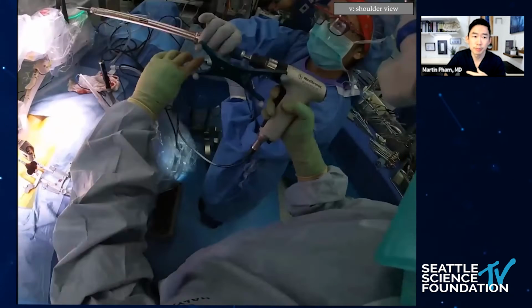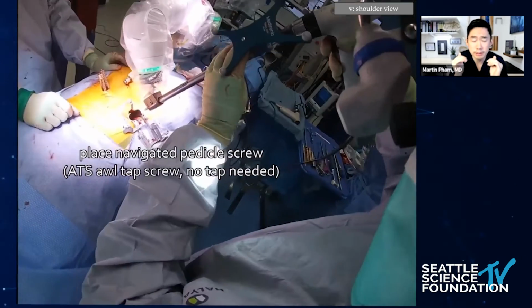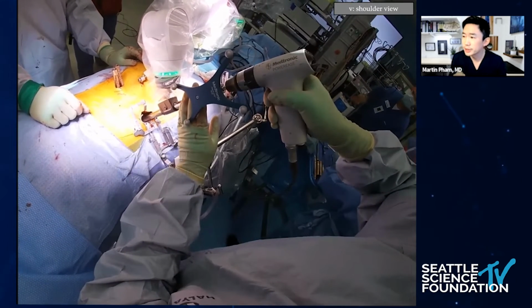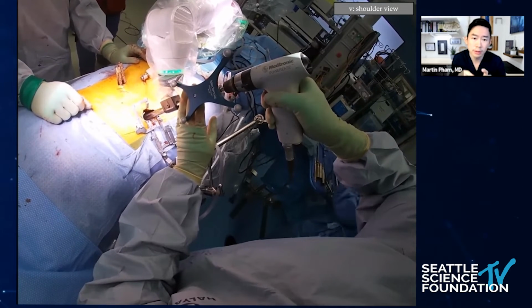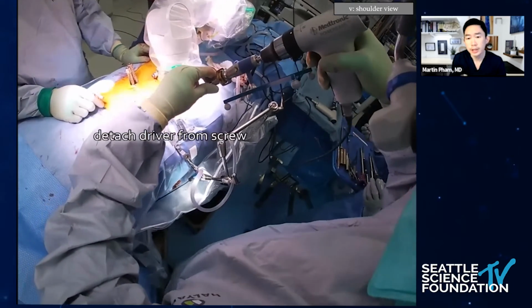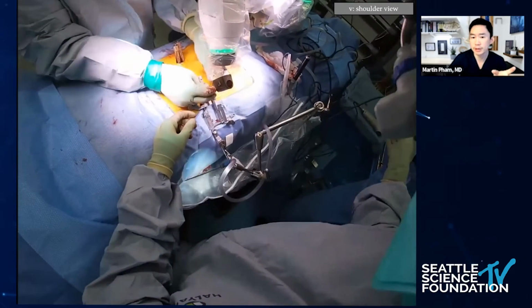So here's an example of putting a screw using the robotic arm down, in this case, a mini open incision using a quadrant, but it's really no different than what you're already doing. So if you're doing your MIS TLIF with either fluoro or navigation, incorporating the robotic system really doesn't change your workflow. In this particular case, it really is just another way of putting down a screw.